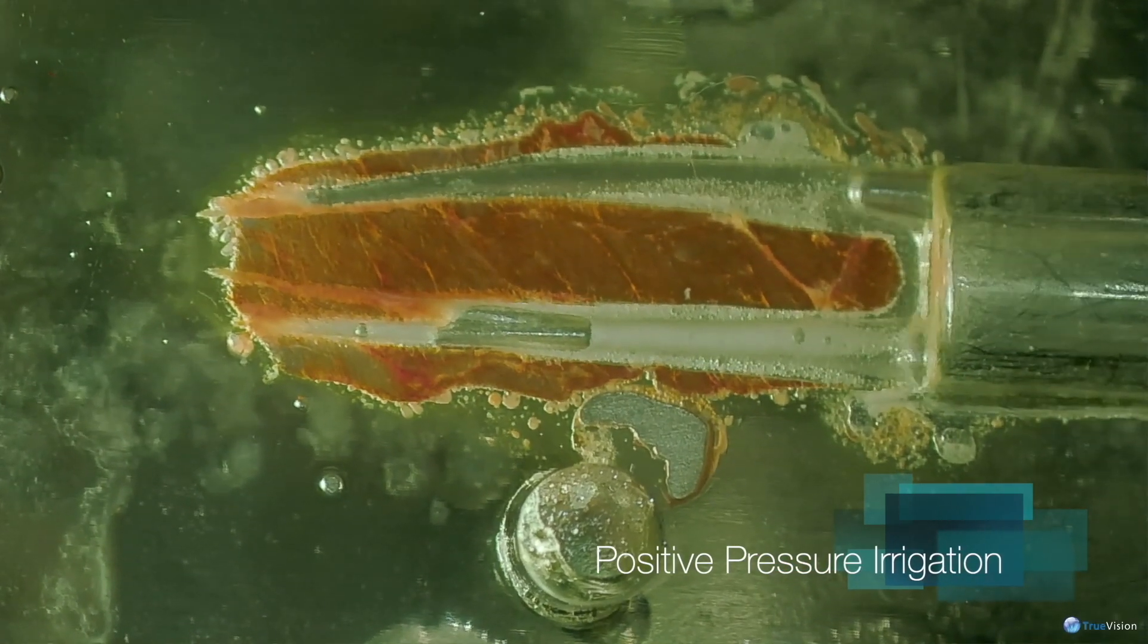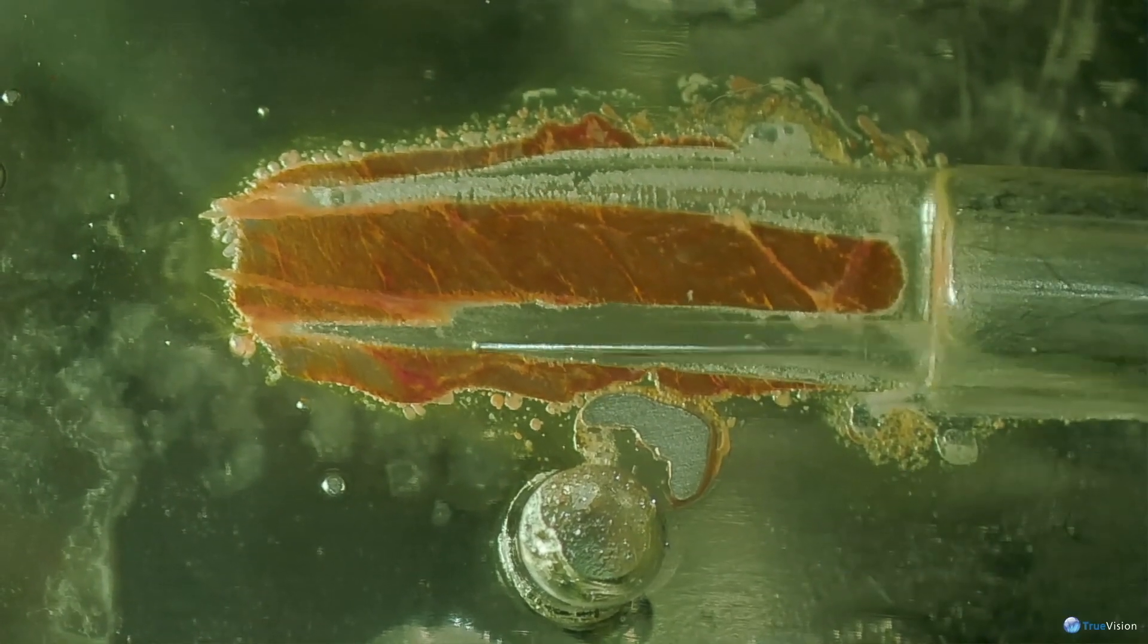Positive pressure irrigation is quite effective at flushing the debris out of the primary canals. It's not doing anything to the lateral recesses. We're now depending on the hypochlorite to do what it does best, chemically dissolve, digest.